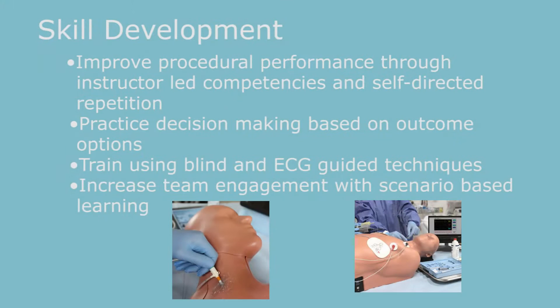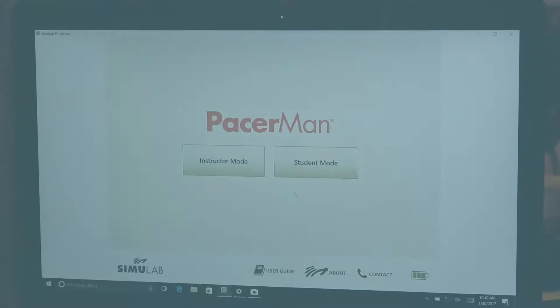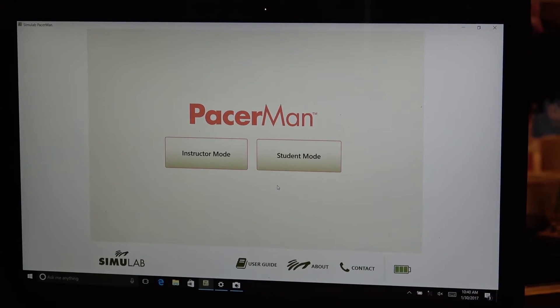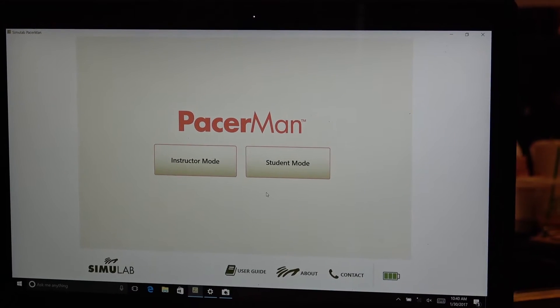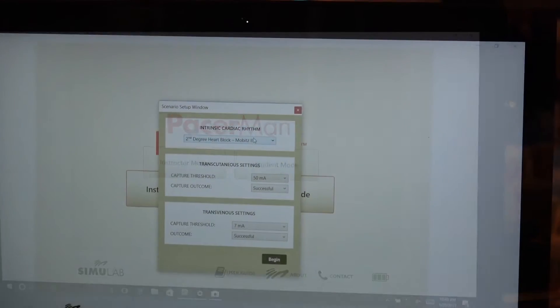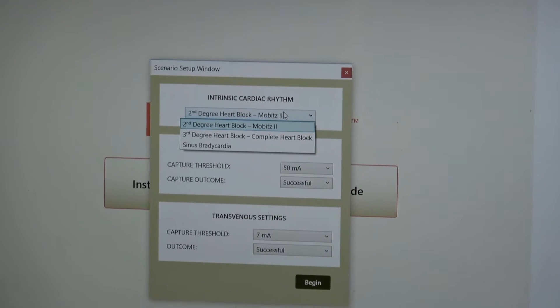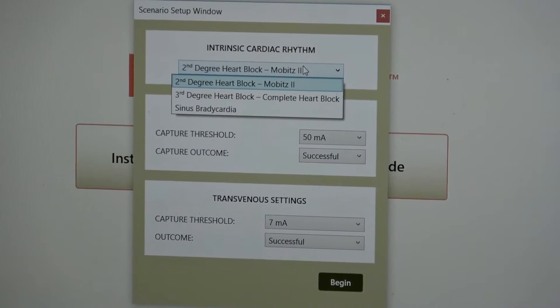There are two modes for the Pacerman system: instructor mode or student mode. In student mode, we can randomize all the outcomes so the student can approach the system and run through a scenario without knowing what is going to happen. In instructor mode, we can choose the intrinsic cardiac rhythm and determine how we want our patient to present — whether it's third degree or second degree heart block, or a sinus brady.